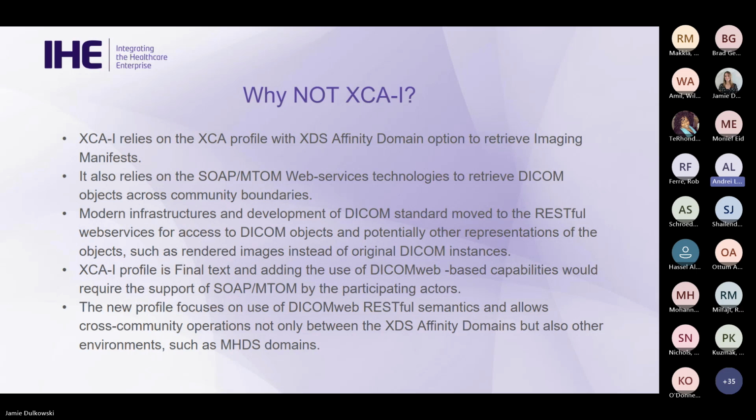One who is familiar with developments of profiles in both IT infrastructure domain and in the IHE Radiology domain for quite a while might say that, well, that sounds pretty much as the XCA for imaging profile, or XCAI, which have been in trial implementation for quite a while, and just very recently has been promoted to the final text, and it is a part of IHE Radiology framework.